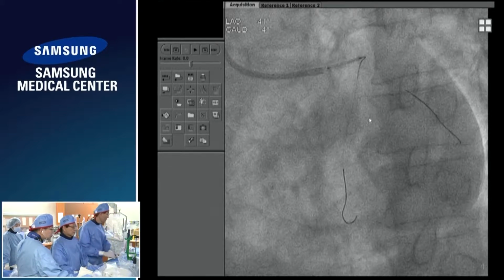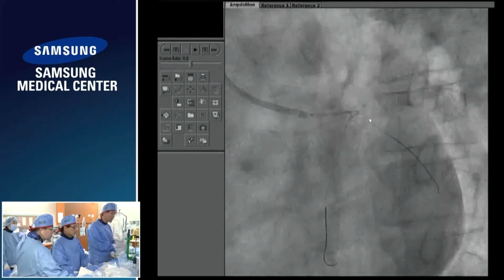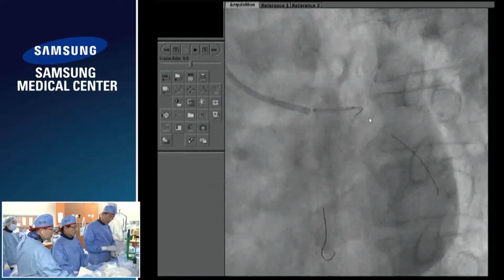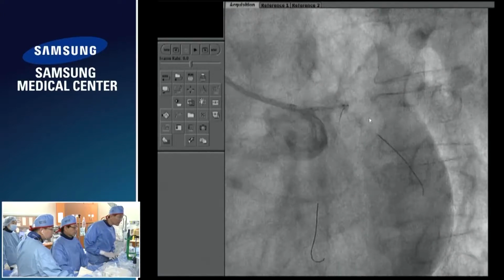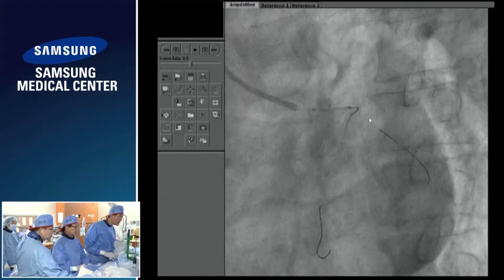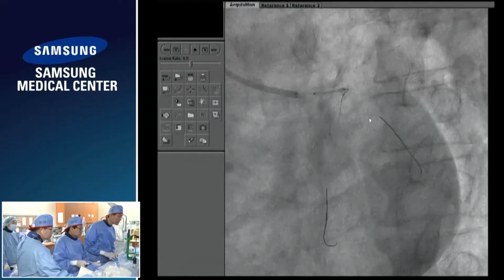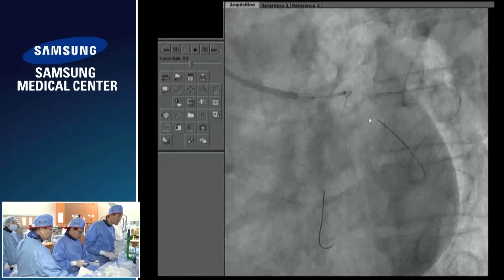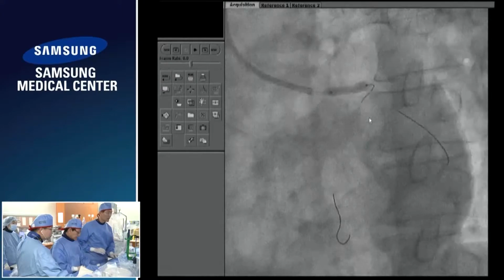This is what I mean. Okay? Patient, breathe in deeply, breathe out halfway, yes, hold your breath. I hold the breath. Okay, inflate. 8, complete. 8. Yeah, you can breathe. Yeah, just 8 atmosphere.